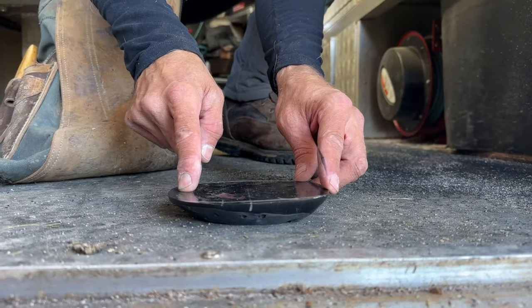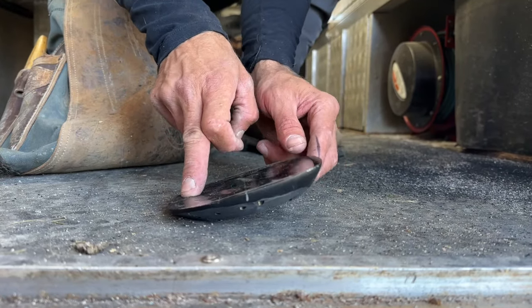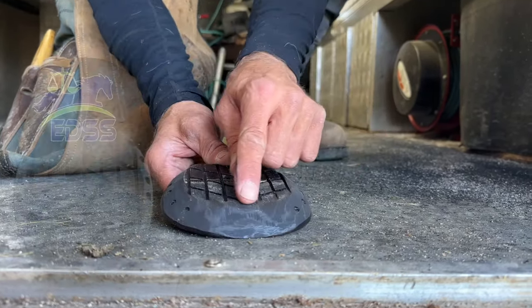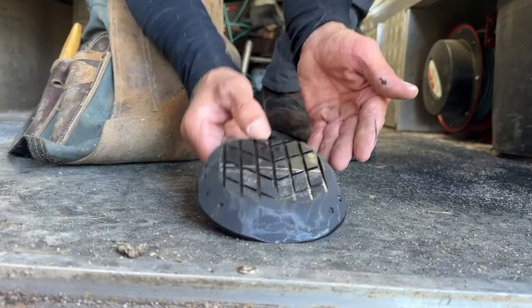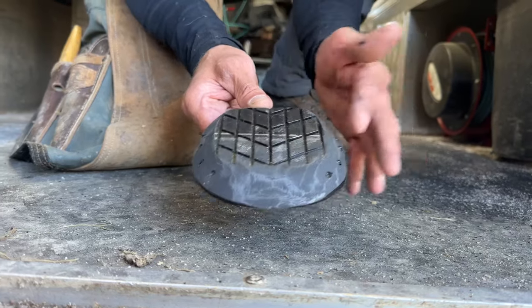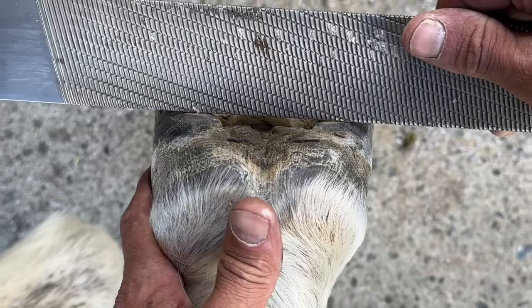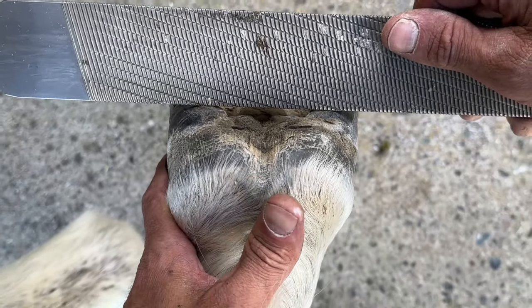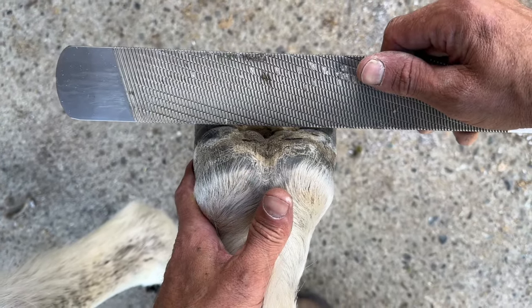So here's the roller motion from the center of rotation. There's my breakover. And here you can see that I've accentuated where my cast is going to lay on this clog so that I don't lose the mechanics that this horse needs. So you can see here that our frog isn't engaged with the bottom of his heel. So we're going to add dental impression material to help support the load of the back of the foot.